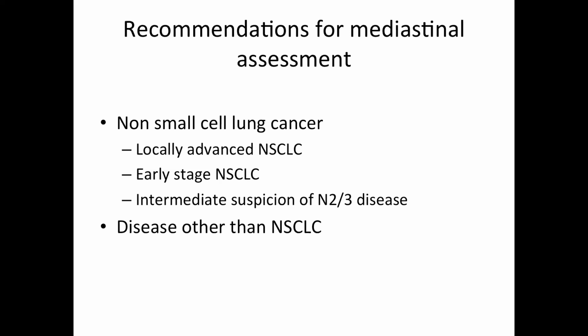If we've got early stage non-small cell lung cancer, the reason for the mediastinoscopy will of course be if there are any queries that we need to confirm that we are indeed early stage and can proceed with a potentially curative treatment option, including obviously lung resection. Or indeed if there's an intermediate suspicion of N2 or N3 disease, and we'll come back to that later.